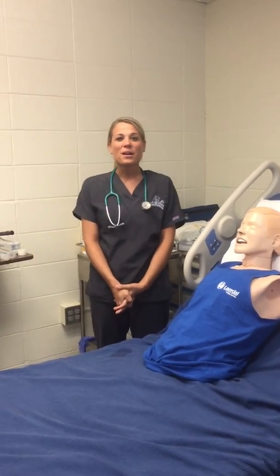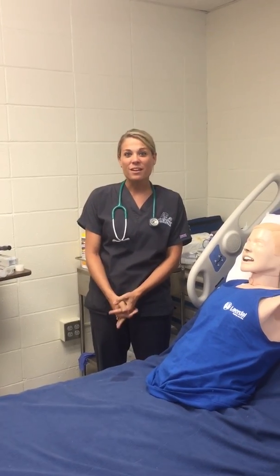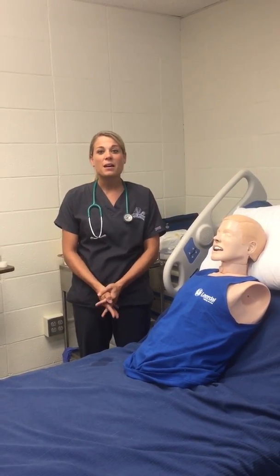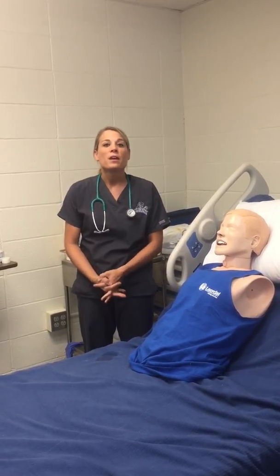Today is September 21st. It is approximately 12:45, and today I'm going to be demonstrating insertion of an NG tube and administering medications through an NG tube and removing the NG tube.